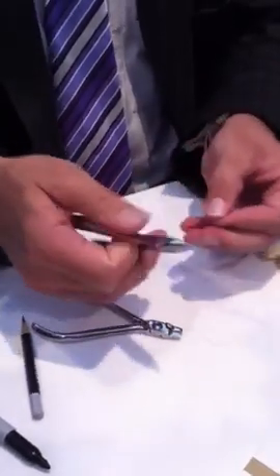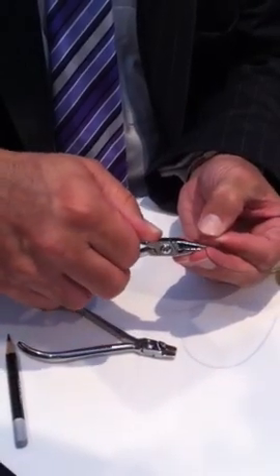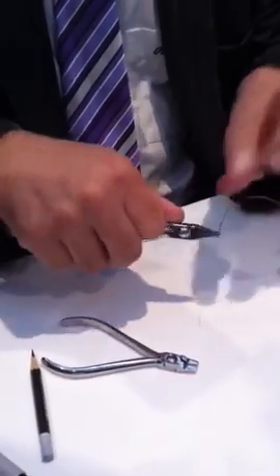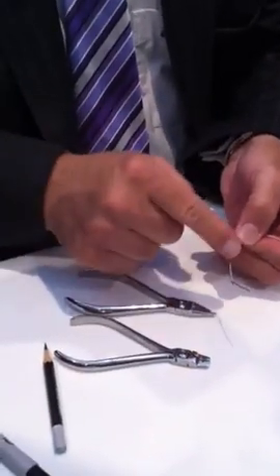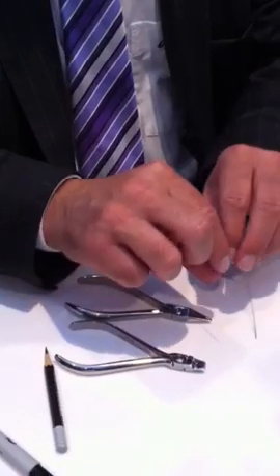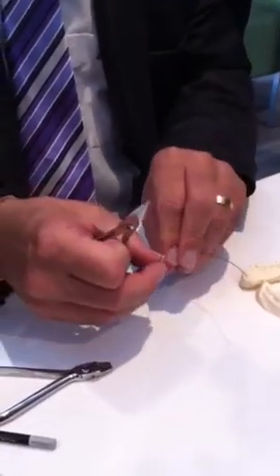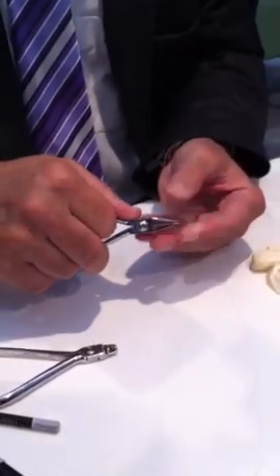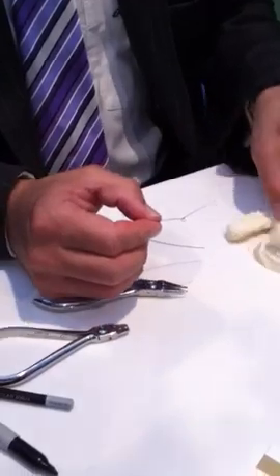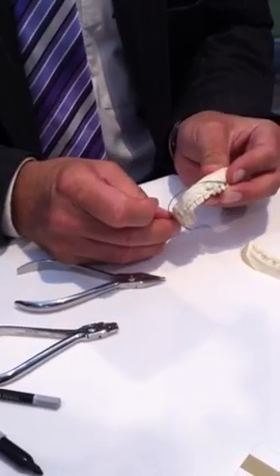Then using the Jarabac plier — you can see you've got one round component — on the round component you bend, and then you bend the loop right round. Now make sure when you bend that the bend is buccal of the wire, because if it's lingual of course it won't go in the molar tube — that's one of the common errors I see people make. The amount of intrusion is determined by this angle. An excessive amount of intrusion is about 45 degrees. What we want is about 20 degrees of intrusion — more like that. Now if I just put this on this model and place it in front of the molar, you can see how powerful the intrusion force is already.